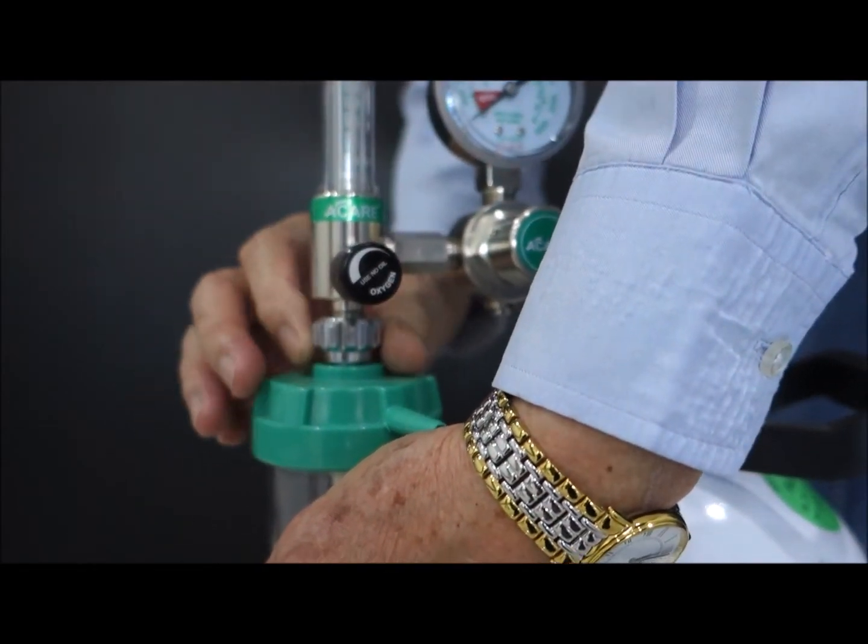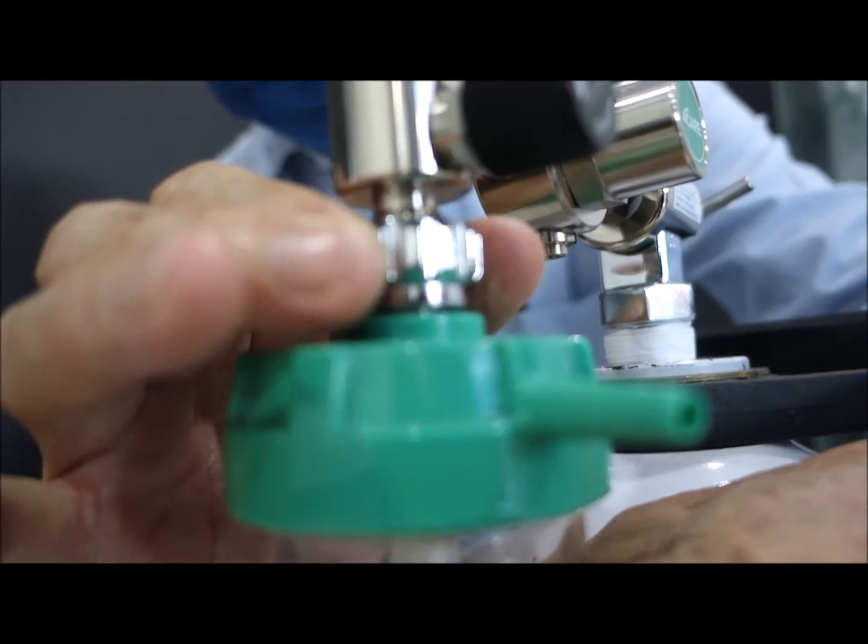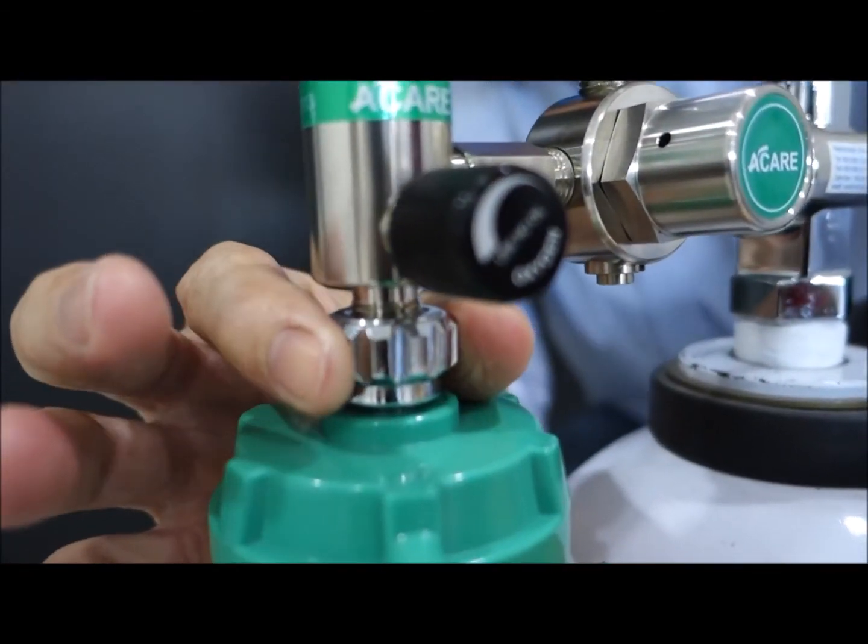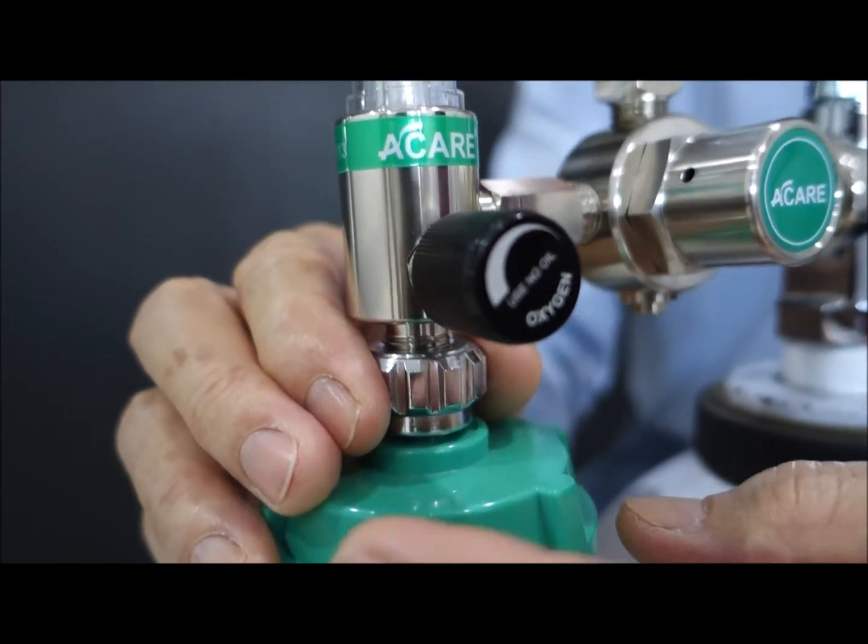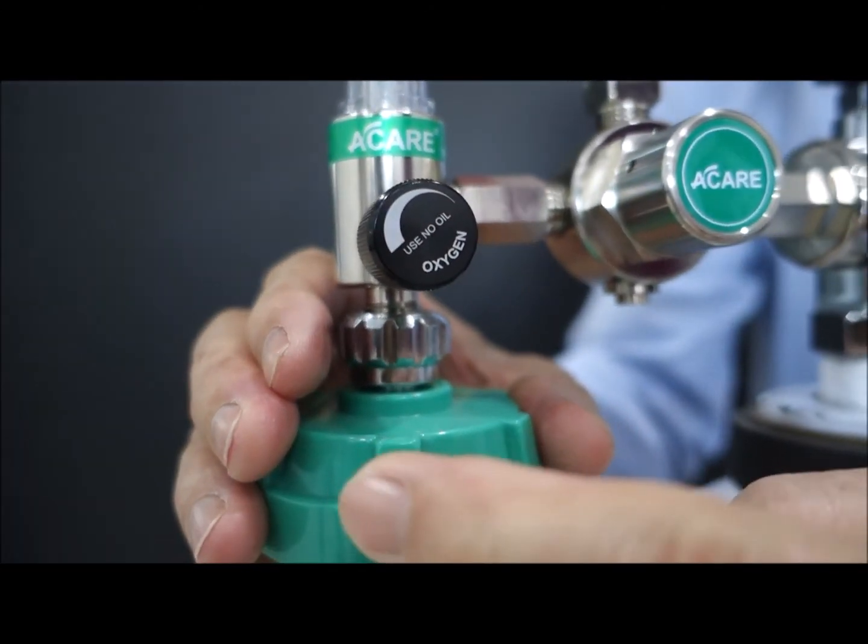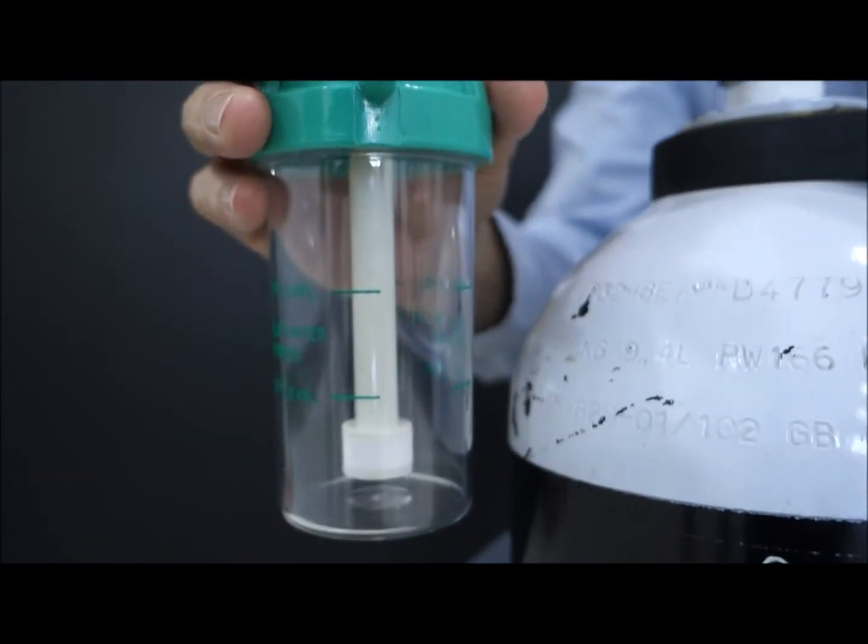If you look down there, it's going to be clockwise to disconnect, anti-clockwise to turn on to connect the humidifier to the flow meter. And this is the nozzle here, where you connect to your face mask or your nasal cannula.